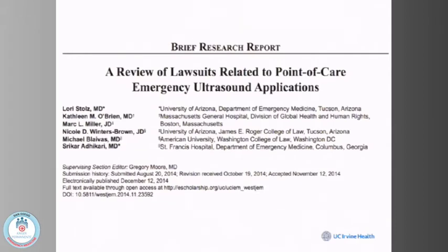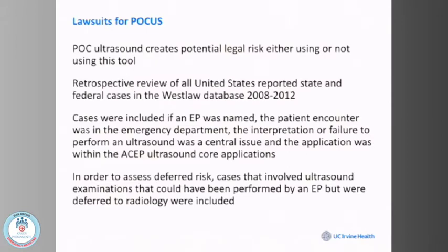And so that's just something to think about. If you're trained in ultrasound and then you don't use it, and the patient has a negative outcome, you're more likely to get in trouble in that vein than if you use it and you make the wrong decision based on its erroneous results.